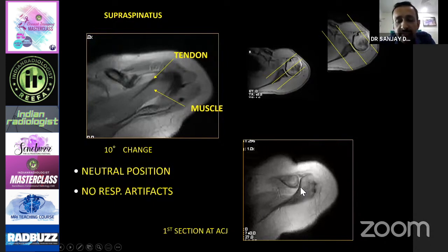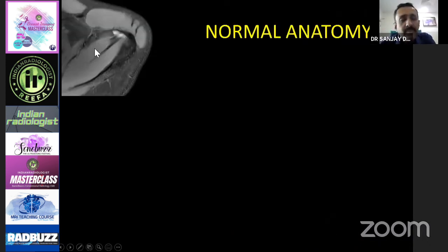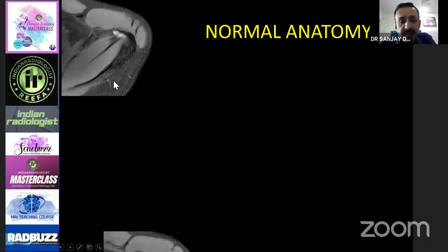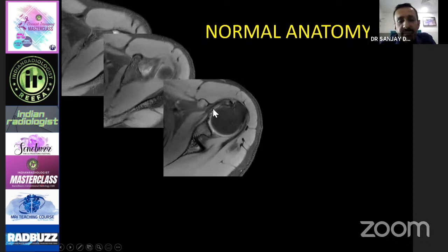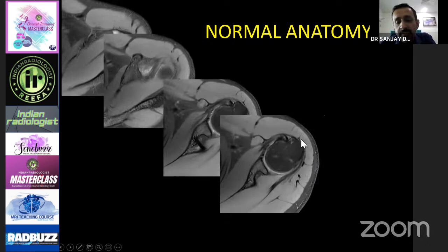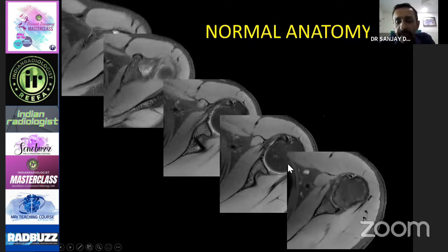One important thing to remember: the first section has to go through the acromioclavicular joint. If it does not, you are going to miss os acromiale and its different types. Going from top to bottom, you see the supraspinatus muscle and tendon. As you go down you start seeing the long head of biceps, then the subscapularis and infraspinatus tendons. The infraspinatus tendon inserts at a specific point — not where it is most commonly thought. The subscapularis goes to the lesser tuberosity and does not go beyond it.